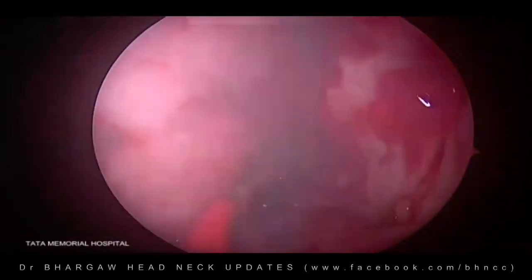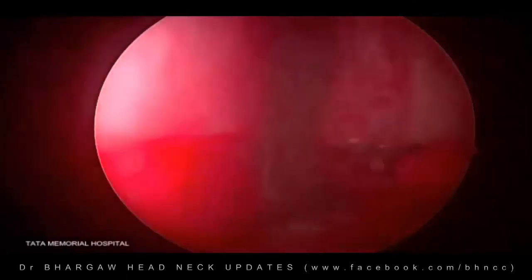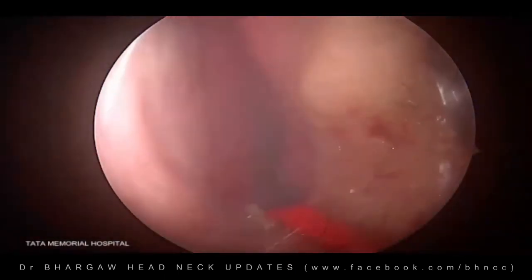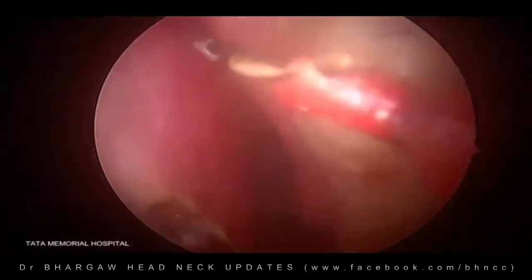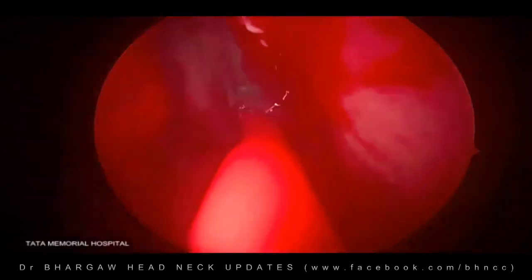We gave the incision inferiorly onto the septal floor, an extended Hadad flap, and anteriorly we came all the way to the mucocutaneous junction. Because you have to go into the anterior skull base, it's better to have as much flap as you can.